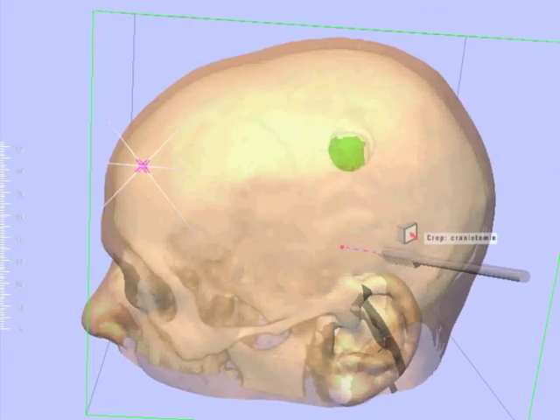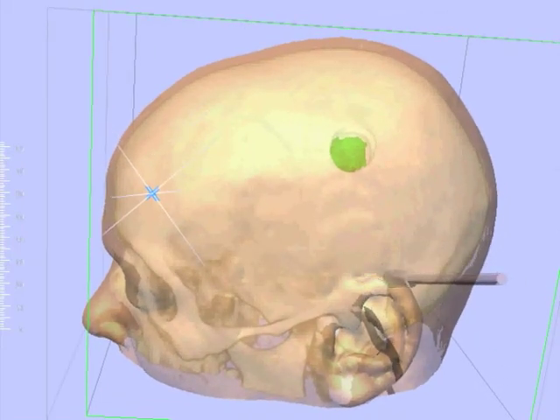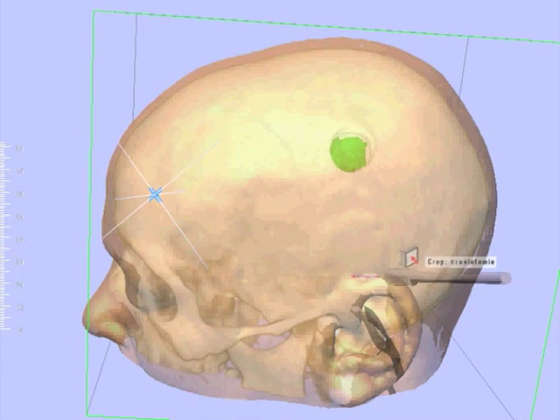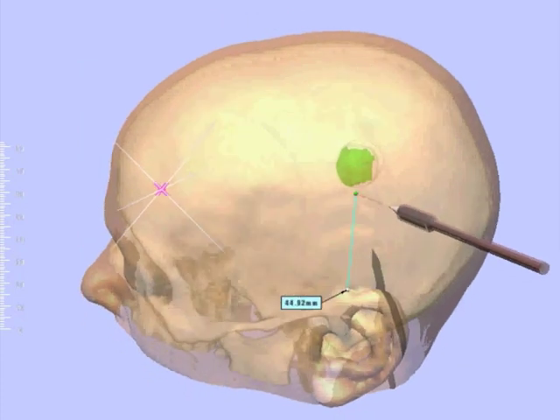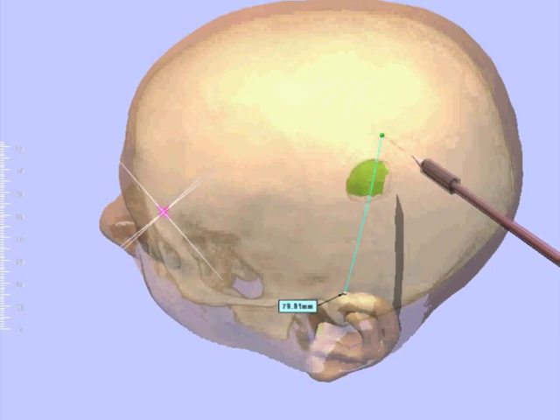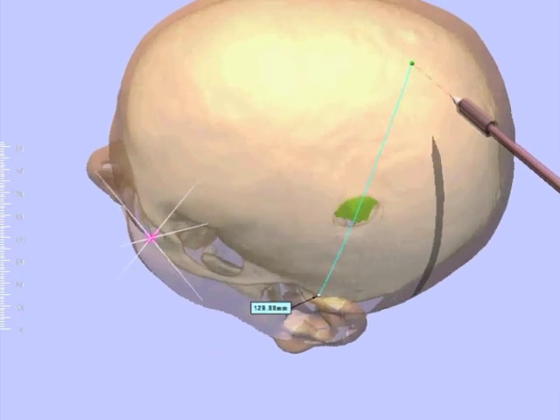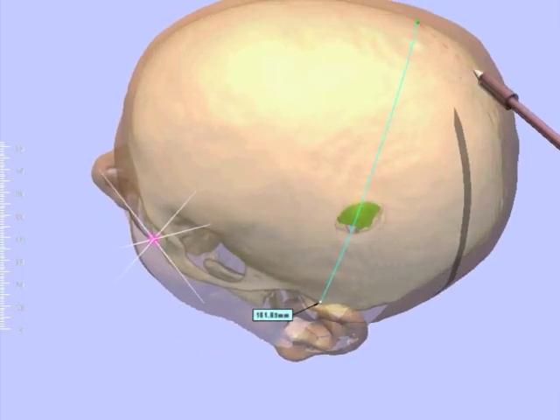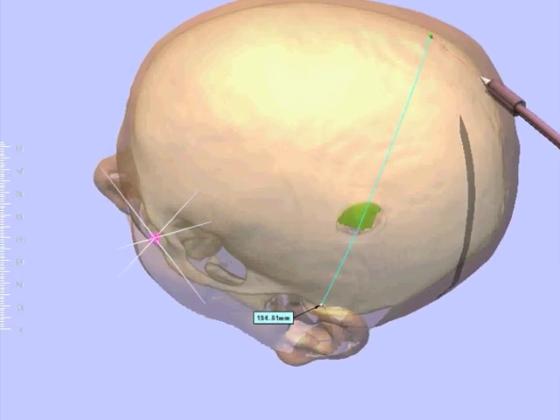In this case of a left-sided parietal meningioma, we begin our virtual reality-aided craniotomy planning by drawing an auxiliary line using the surface measurement tool. The line extends from the upper and anterior insertion of the auricle to the midline, crossing the planned craniotomy in its center.